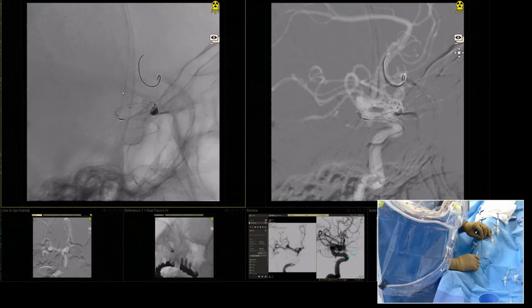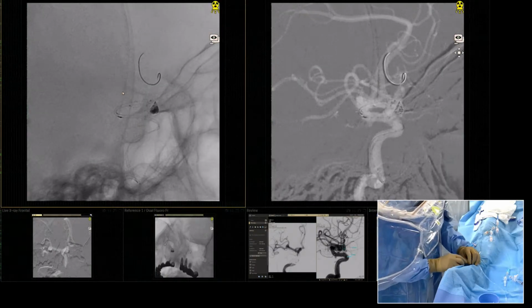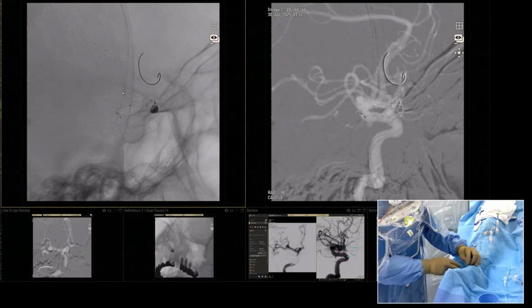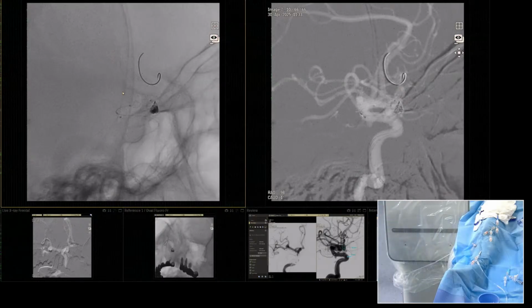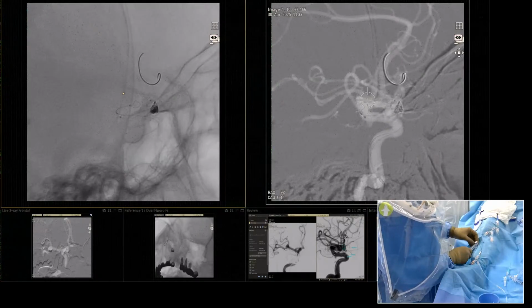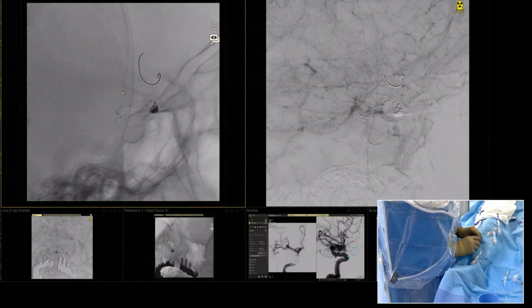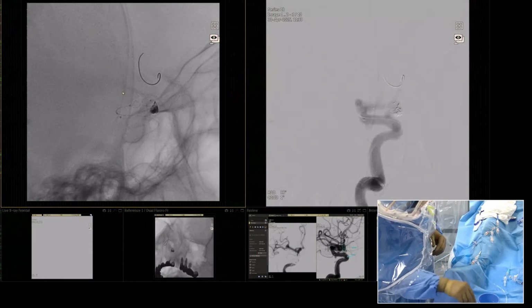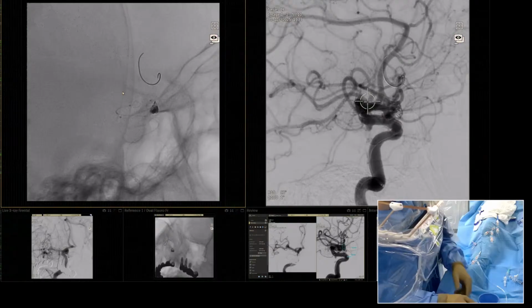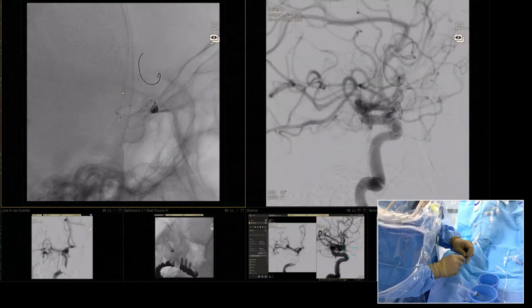Just last half millimeter. And now it's in poor condition, that's why we need to use it like this. It's better to use one time, but the distal part of the coil is not moving, no need to be sterile, and it's just retrieving after the placement. I think it's enough. It's a little bit filling, but it will thrombose, and the upper branch is opened.